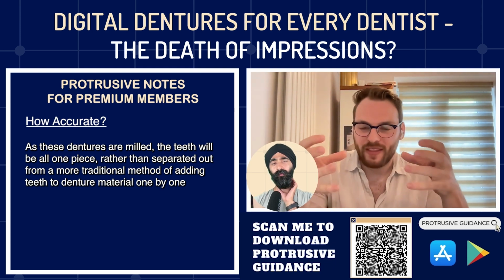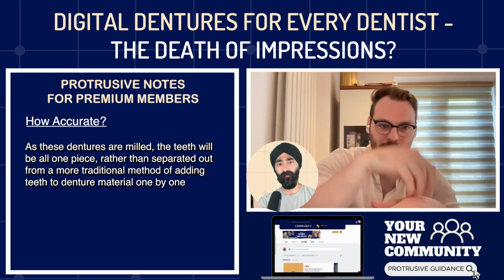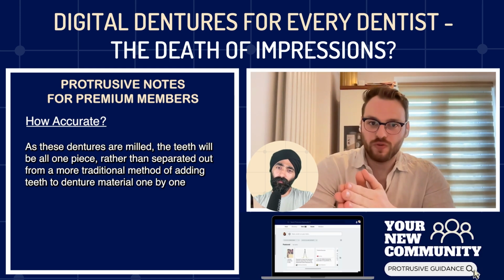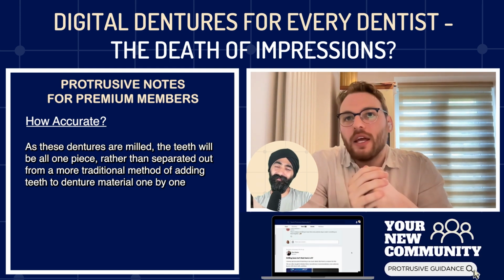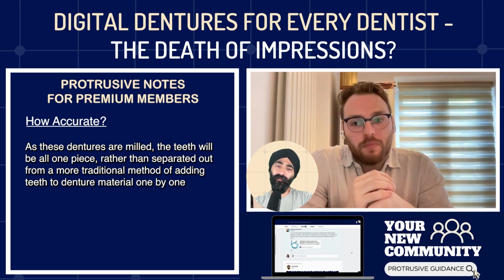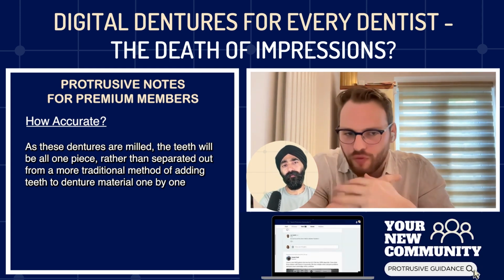So you don't get that really nice separation like you do with the conventional mounting teeth inside the wax. So there's a lot more work dressing it up to make it look pretty, to put a disc in between, put a bit of tinting in. Yeah, because I've done it, you can look at them and you can work it out. But from an extra-oral smile photo, things like that, you can't really tell the difference.